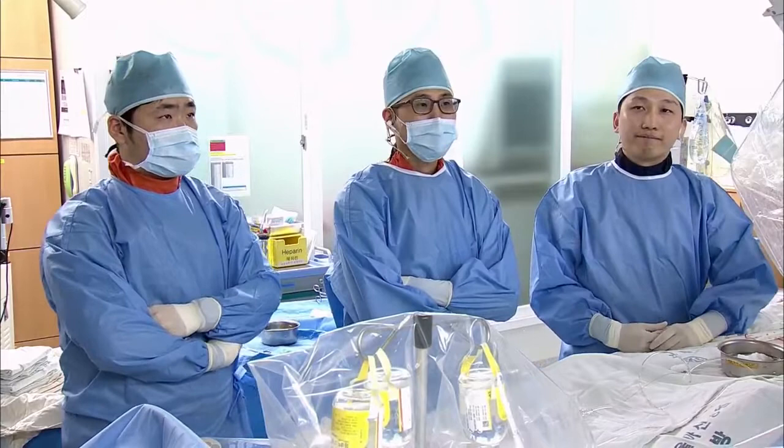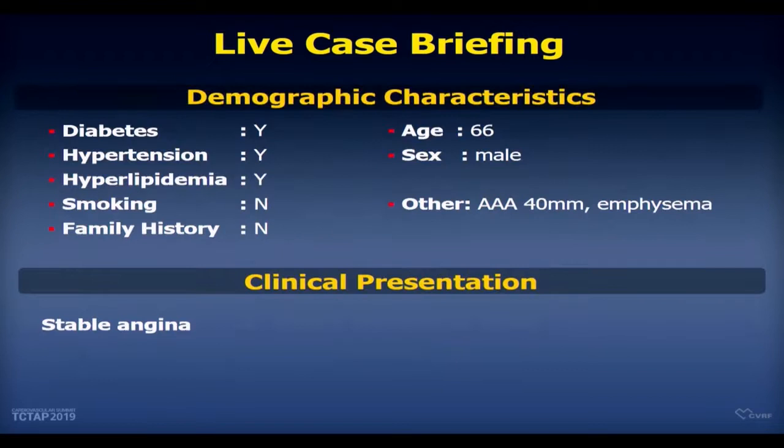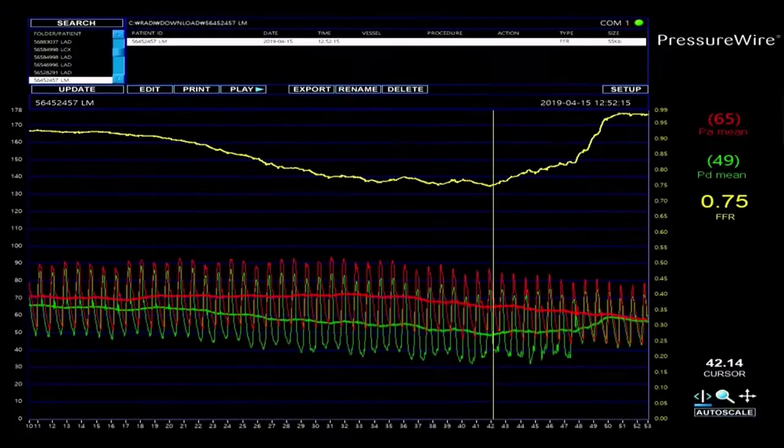This patient is a 66-year-old male. He complained of exertional angina one month ago. And he had cardiovascular risk factors: hypertension, diabetes, and hyperlipidemia. Left coronary angiogram showed a focal significant stenosis at distal left main and proximal LAD ostium. He has an abdominal aortic aneurysm, but the size is 40, maybe observation. Echo shows normal systolic function. Right coronary is normal. We checked the FFR at hyperemic proximal LAD, 0.75.